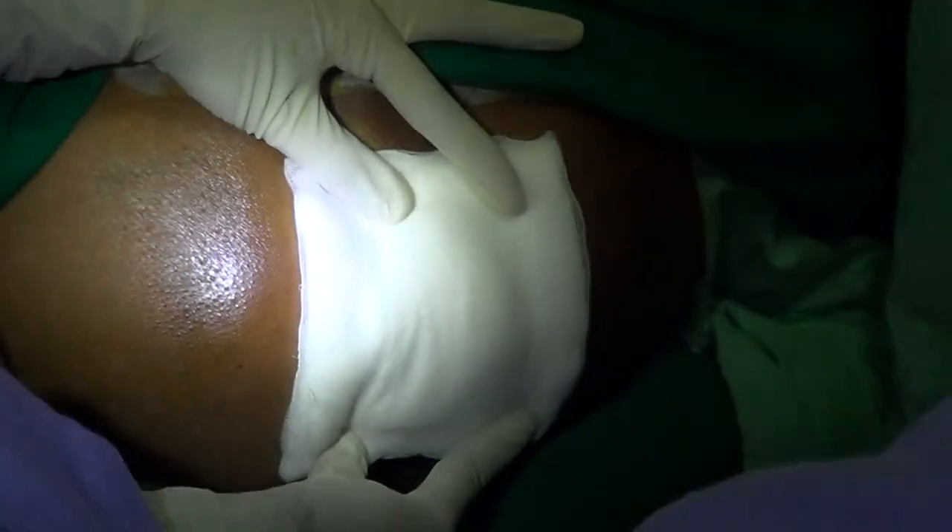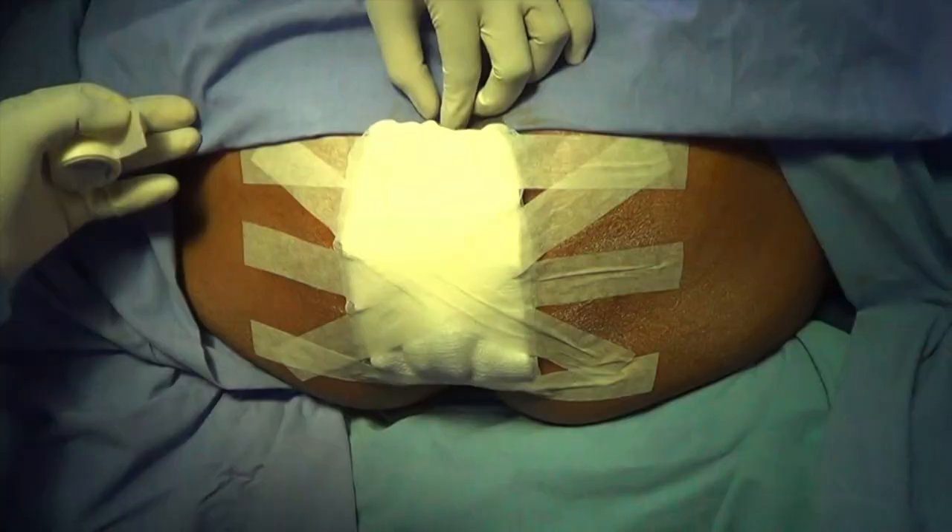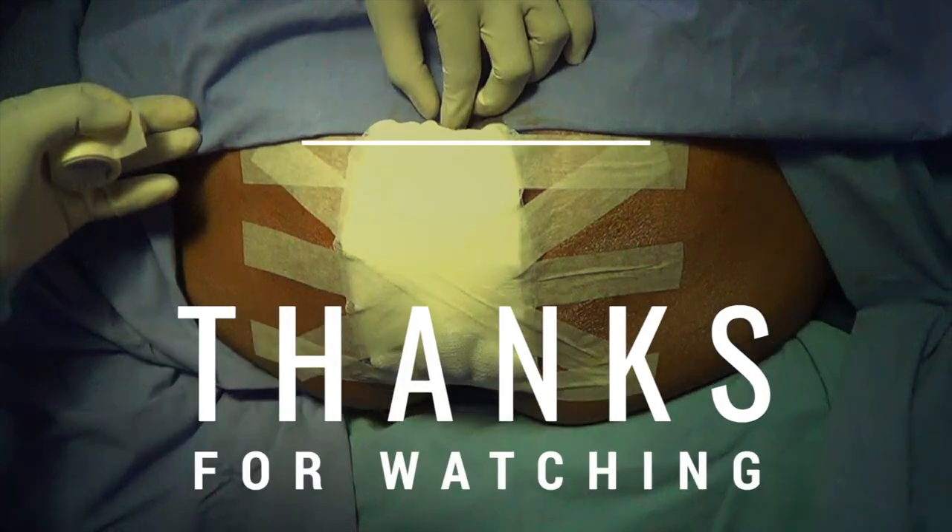Keep a bunch of gauze piece and then a gamgee pad — this is for the comfort of the patient. Put a plaster. We don't use T bandage. This surgery will work like magic. The patients themselves can remove the plaster and go to the toilet happily. Thank you very much for watching this video. Your comments are welcome.